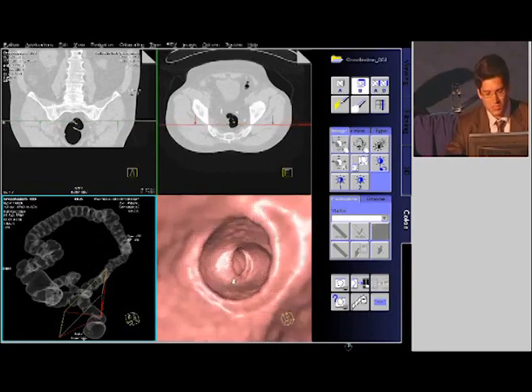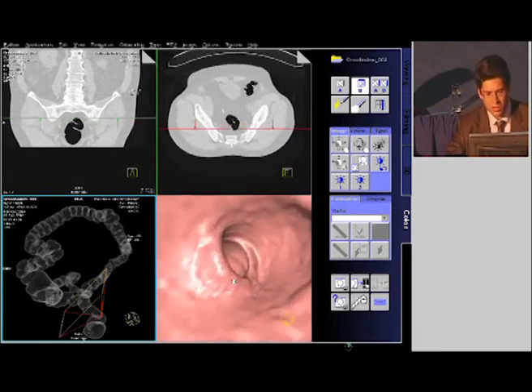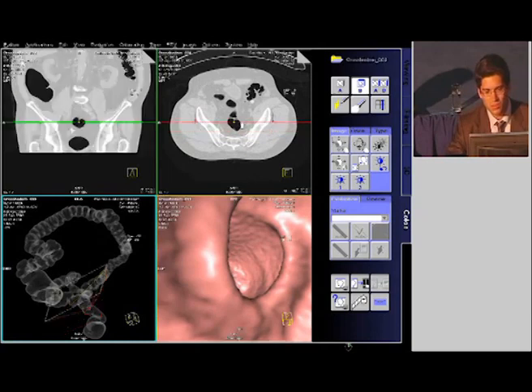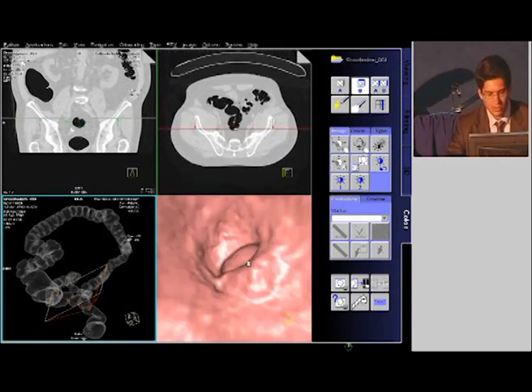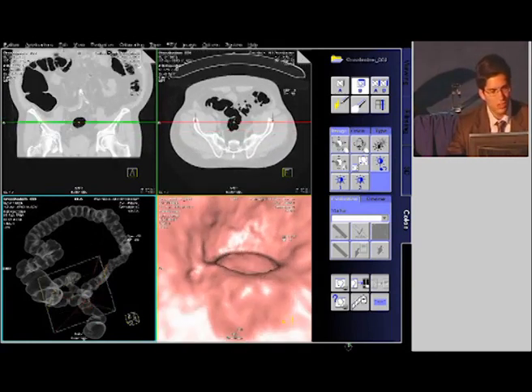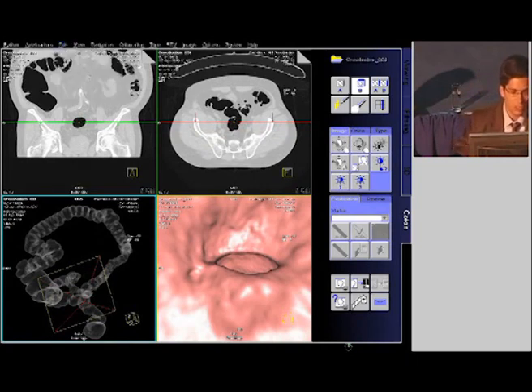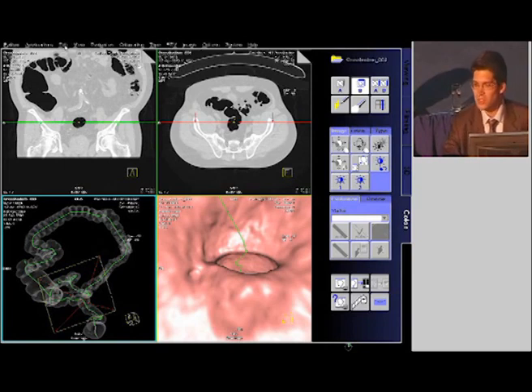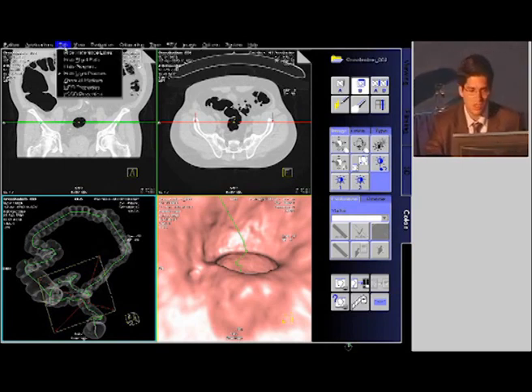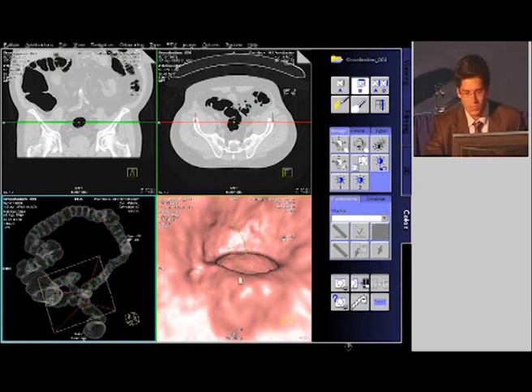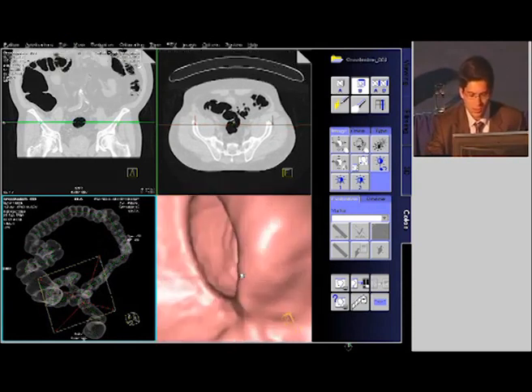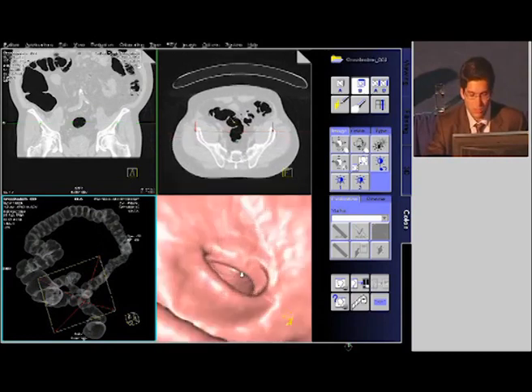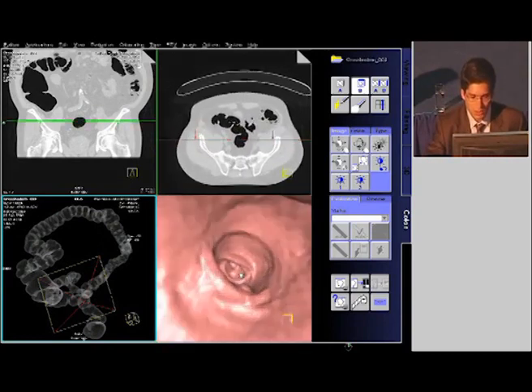I stopped flying on this patient here and you can see how the 3D image is actually being displayed. The axial view up here, with the patient in the prone position, is automatically updated while I'm flying. Normally you would see a green center line here, which I can switch on by showing the flight path — I already evaluated this case, which is why I switched it off. All this is done totally automatically by the software, so there's no need for interaction. I'm flying in this patient looking at the colon, looking for colorectal polyps — lesions that protrude into the lumen.